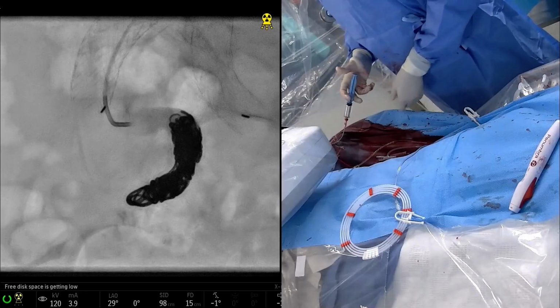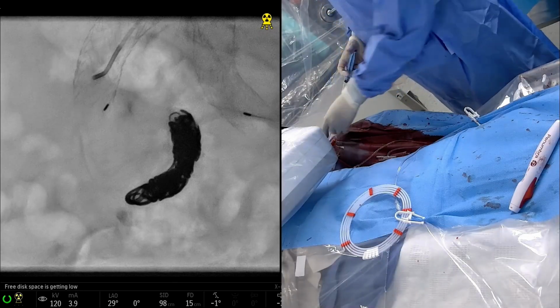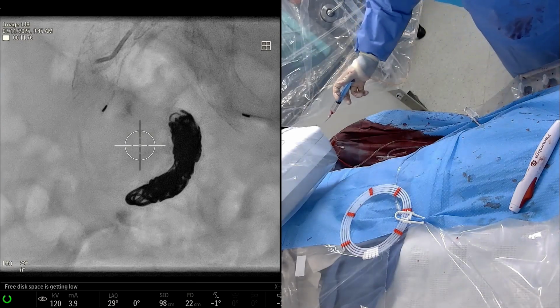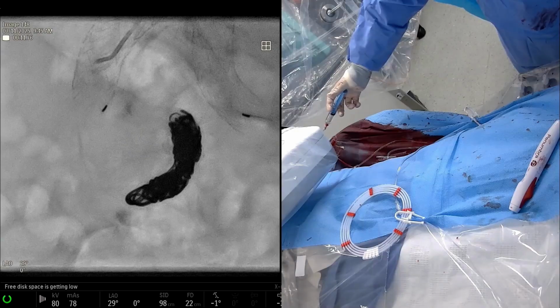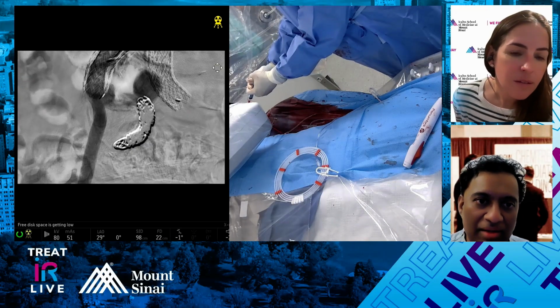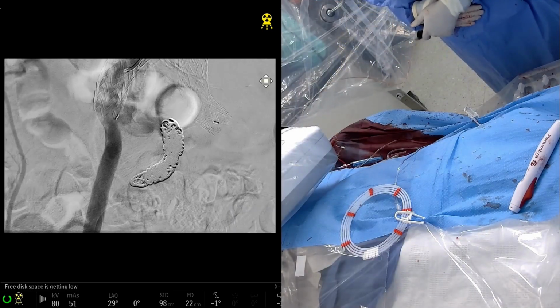Yeah, that's closed, right? I think you're done. So we'll put that stent graft, you're done. That's awesome. We're going to uncouple. Oh yeah, gotcha. Wow, that's pretty good. That's very good, that's great. I kind of like that. We probably could have.